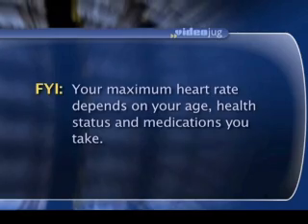During all this time, the patient's blood pressure is also recorded. The electrocardiogram is dynamically recorded to look for any ischemic changes. And then after the radiotracer is injected at peak stress, the treadmill, for example, is slowed down, and the patient is taken off the treadmill. They relax for some time, and then after that, the patient is taken to the camera system for taking additional images, and those additional images are called stress images.